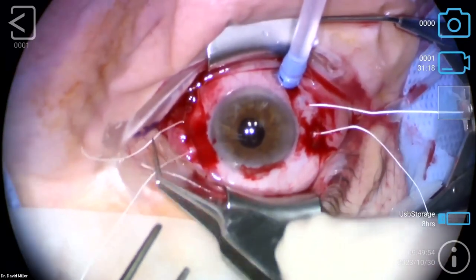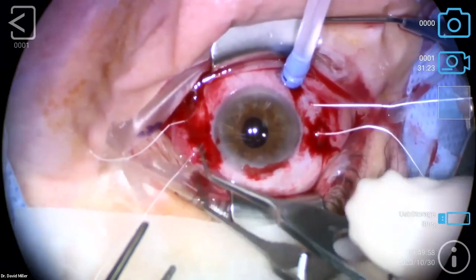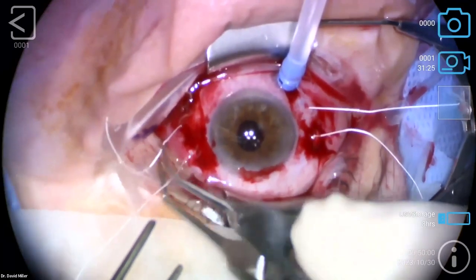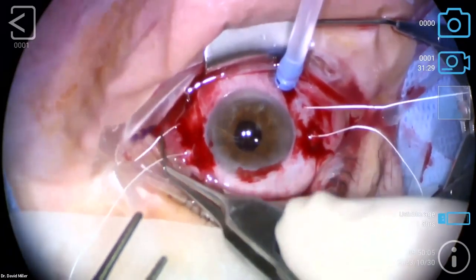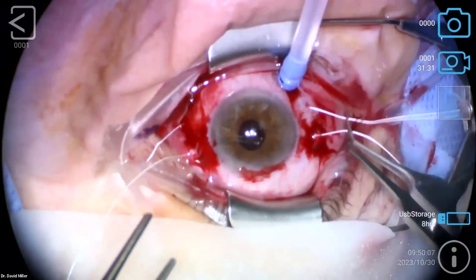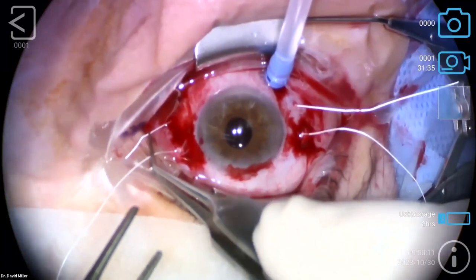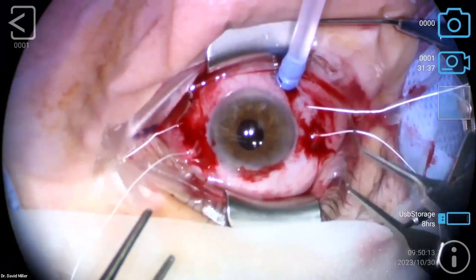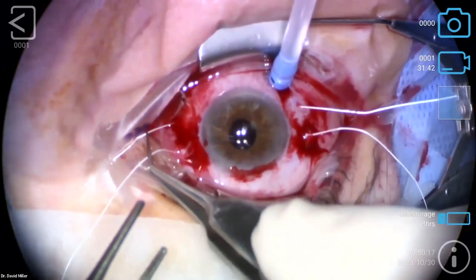It took me a while to figure out that if we took out some of the slack as we were putting the lens in the eye, it saved a lot of wrapping around the haptics. Simple things like that can make quite a difference. You see me going back and forth. I'm trying to center the lens to figure out exactly where we need to be, because the pupil is smaller and you can't see the edge of the optics. But about right there, we're pretty good. Let me take another look at that. There we go.